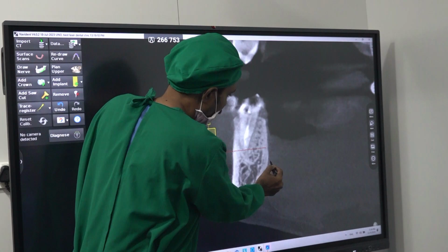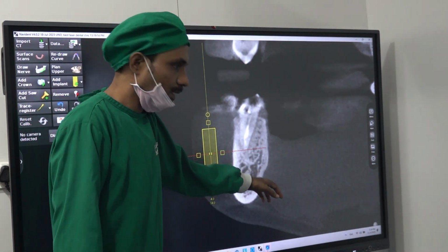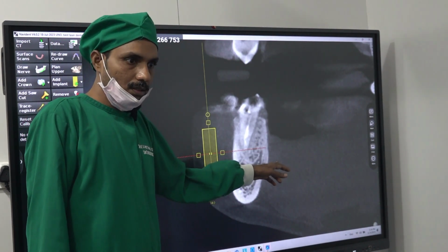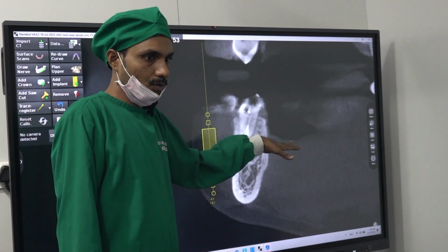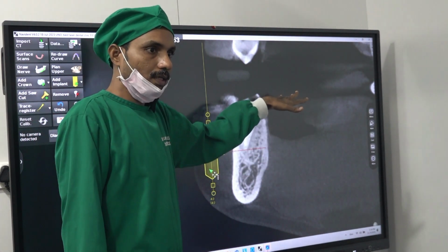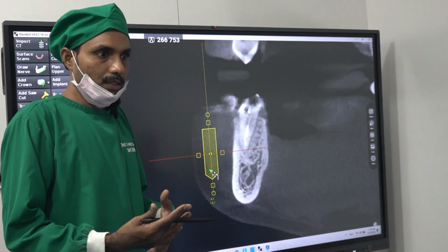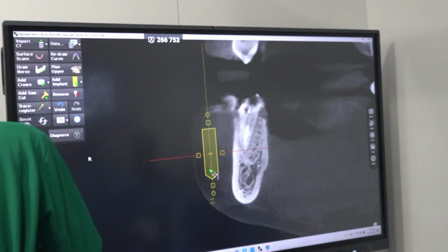It is present but not very prominent. Where is the depression? It is there but not very prominent. So the mylohyoid ridge starts in the first molar area for this patient and becomes more prominent toward the distal root. When it goes to the second molar, it becomes more prominent. So the lingual cortical engagement technique is easier as you go behind. I will show the second molar now.